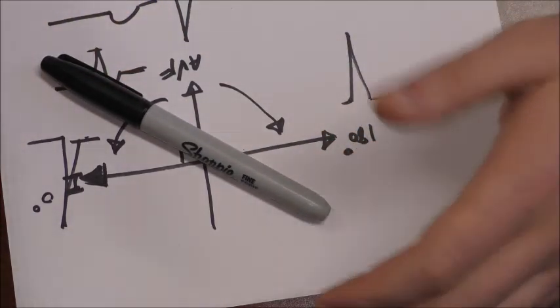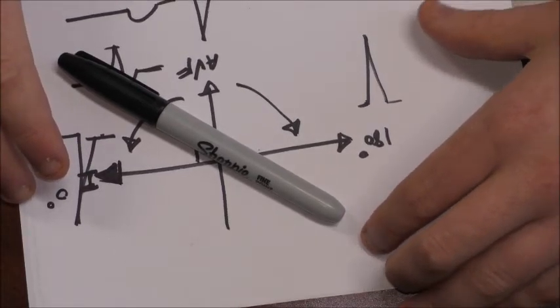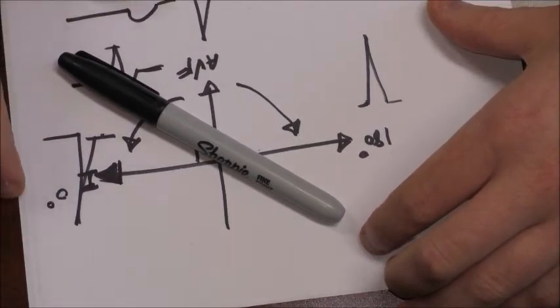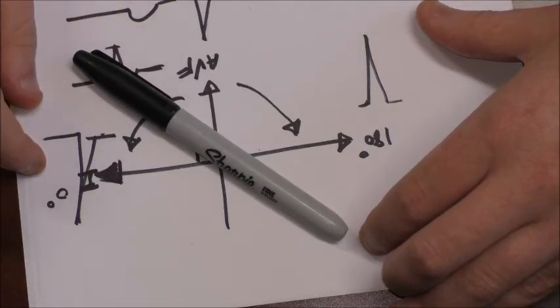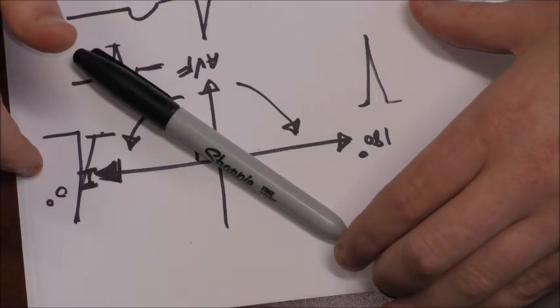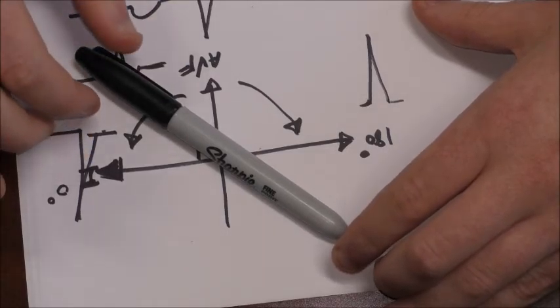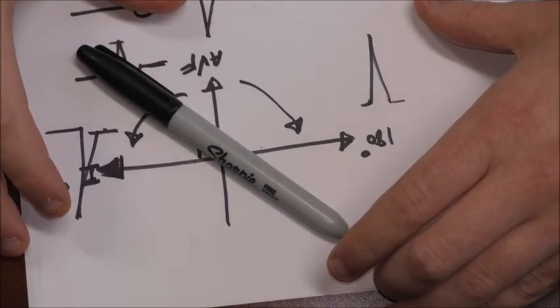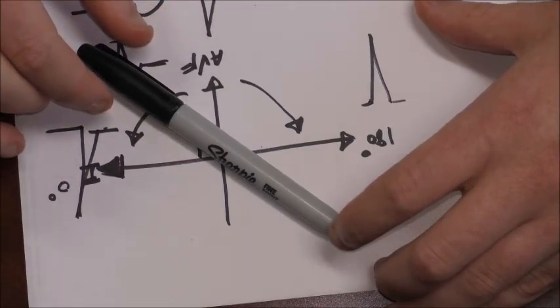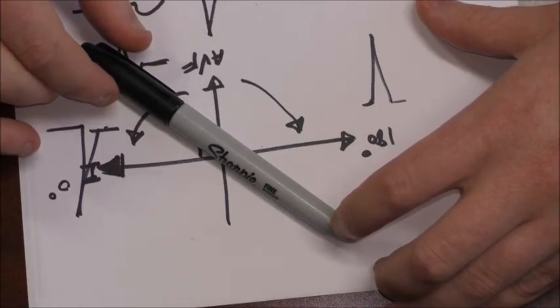So once you have that principle down, you can kind of deduce from other pathologies what you would see. So someone who has long-standing mitral regurgitation, who now has a dilated left atrium, you would anticipate that, again, a bigger left atrium will generate more voltage and therefore pull the axis that way.